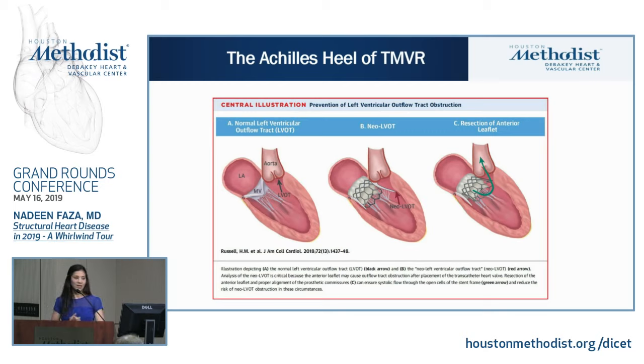And LVOT obstruction is really the Achilles heel of transcatheter mitral valve replacement, because every time you go percutaneously and try to deploy a valve, there's a risk of the LVOT getting obstructed. And imaging, again, is key in predicting this feared complication. There are simulation software packages that allow you to virtually implant a device and calculate the area of the LVOT post-implantation to determine the patient's risk for LVOT obstruction.